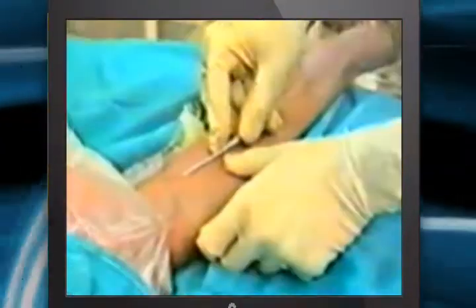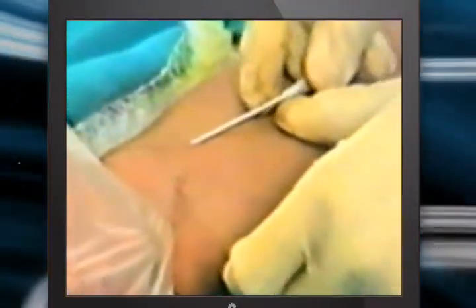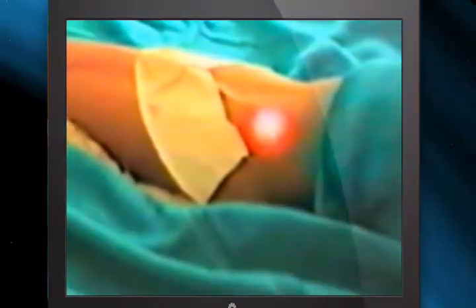In this patient, local anesthesia is given and intravenous helium neon laser is being administered through a gelco cannula.